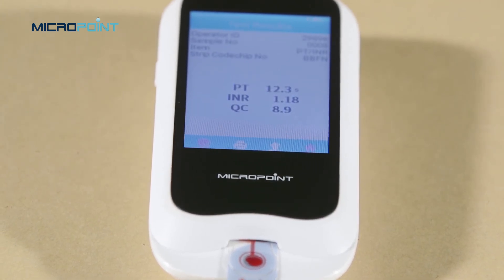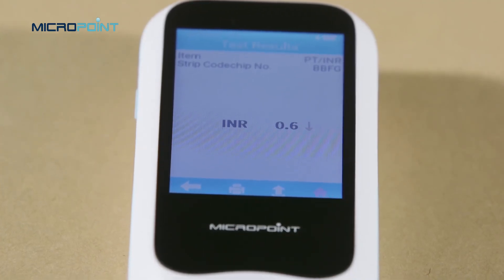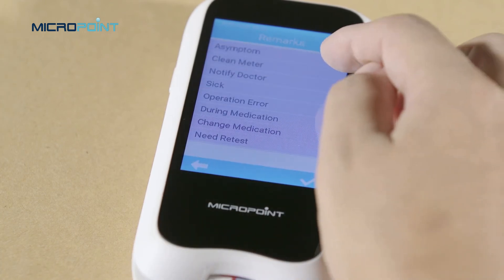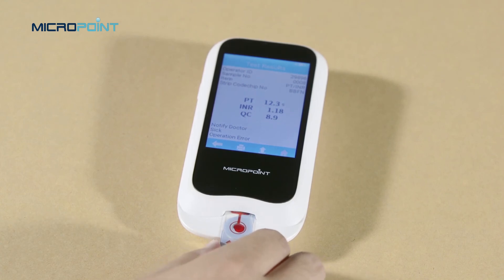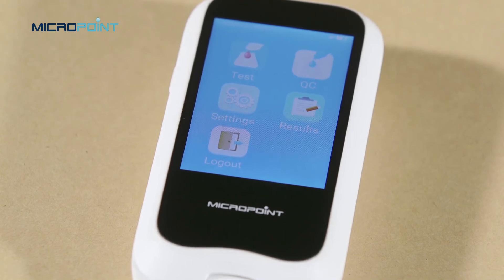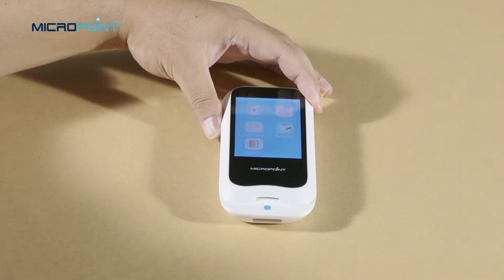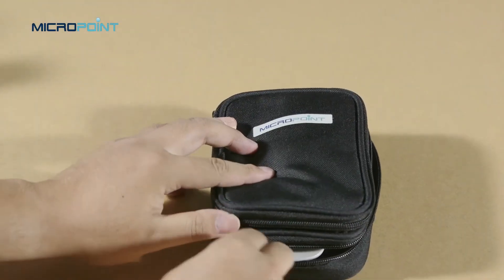The system will display the test results after the test is completed. When the result is out of the normal range, the system will prompt that the result is high or low. Touch the comment icon to add a comment to the test result. Remove the test strip in the direction shown on the screen, then the screen will jump directly to the main screen. Dispose of the used test strips and lancet carefully based on facility procedures. Remember to store everything in the carrying case for the next time.